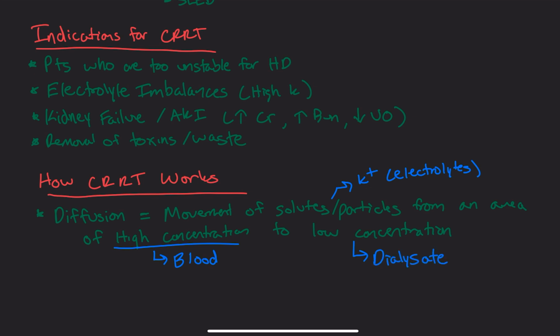And I should say this is through a semi-permeable membrane, and in this case your semi-permeable membrane is going to be your CRRT filter.